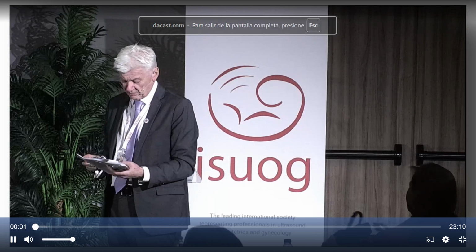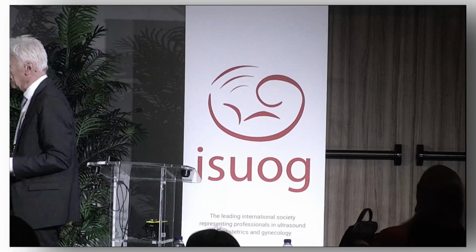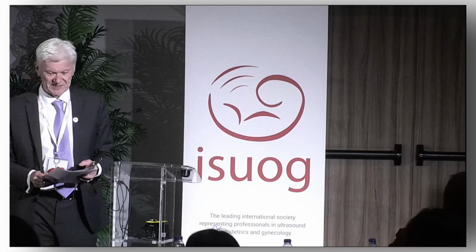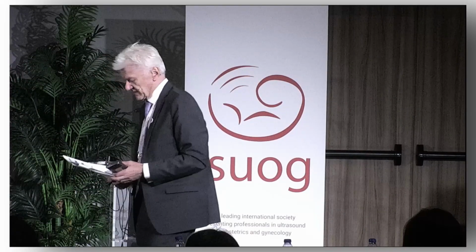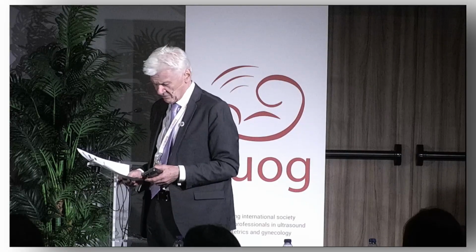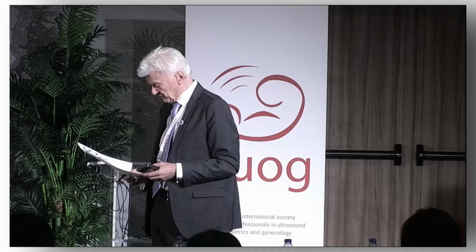We put this on the program really because we felt it was important for the very reason I mentioned early on, that we struggle as obstetricians, maternal-fetal medicine specialists, sonographers, and radiologists with how to deal with irregular heart rates, fast, small, or intermittent ectopics.